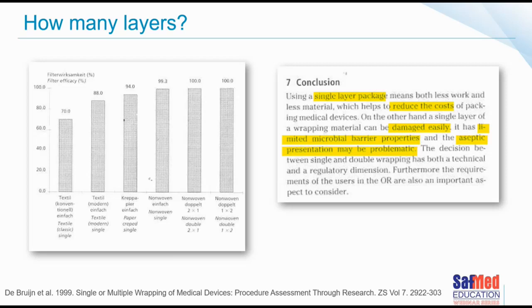one layer of an aseptic bag, maybe that's okay for 24 hours, something packed in 2 layers of an aseptic bag, because remember that's paper-based, maybe that's a week, something packed in 2 layers of non-woven, maybe that gets 3 months or 6 months, so it was a guide that they had created for themselves.